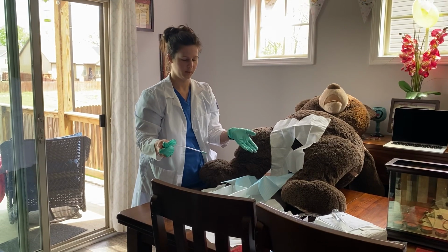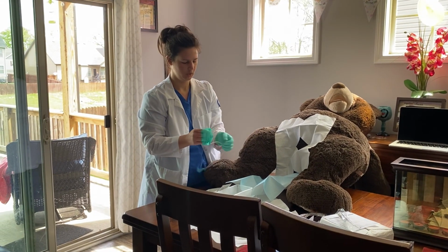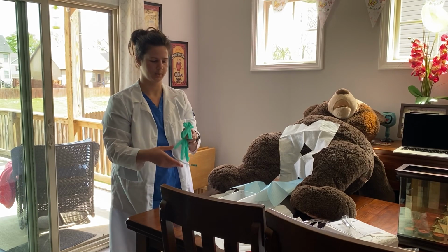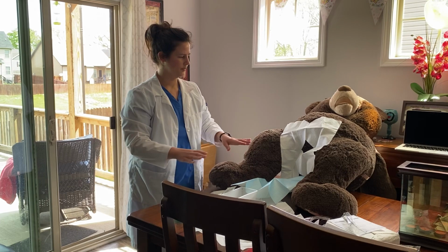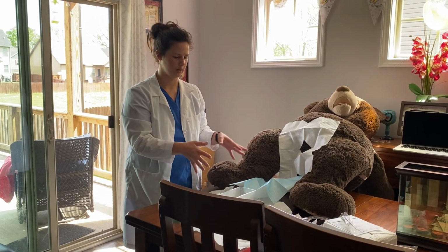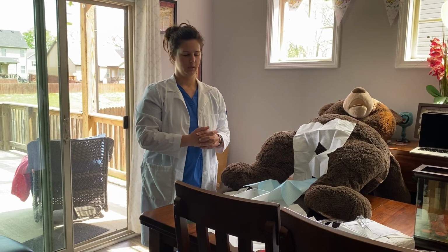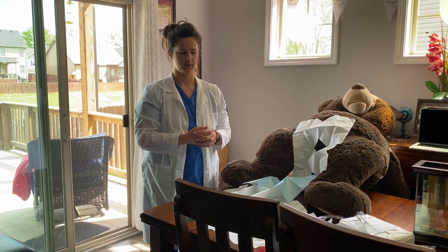And the sterile part is now over, so you can get on regular gloves to clean up and to put the lid on your specimen, and submit that to the lab with the identifiers. Provide any perineal care that you need on the patient, and clean up your sterile field. And that's it for the in and out catheter and the urine specimen, sterile urine specimen collection. Thank you.